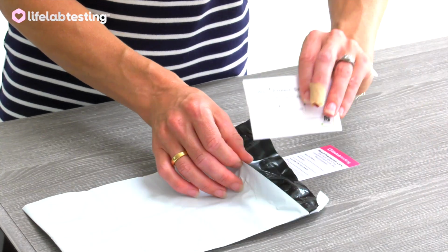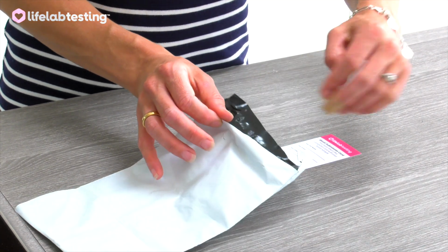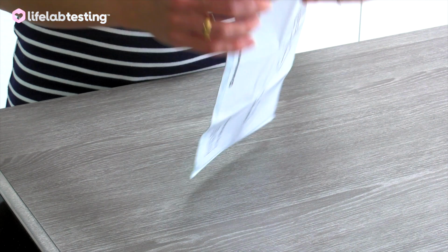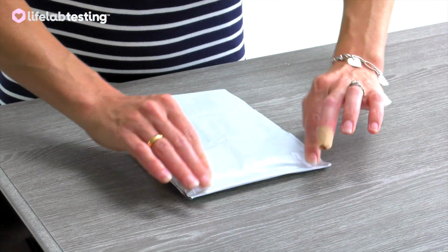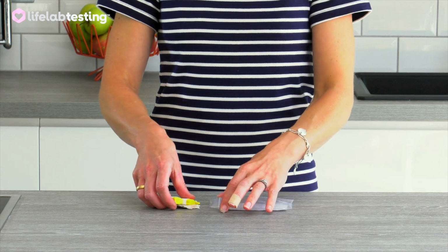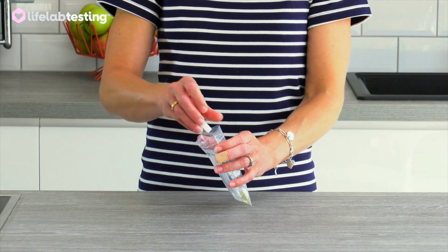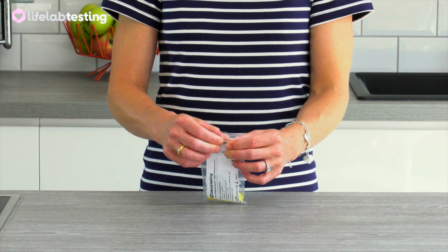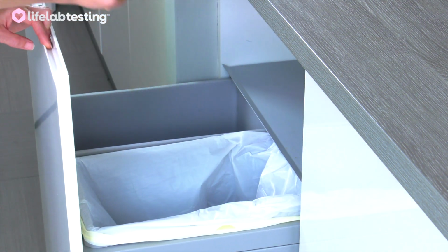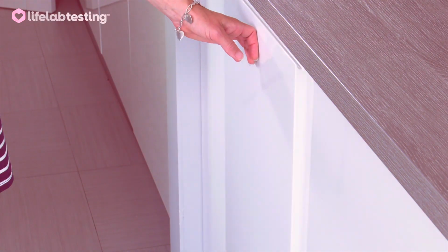Place your completed and dried blood spot collection card into the enclosed prepaid envelope with your completed blood submission card. Close the envelope carefully and immediately post it back to our lab. Place the used equipment parts into the provided clear plastic bag and place them in the trash. Please note that the tests, packing and paper information sheets are all fully recyclable.